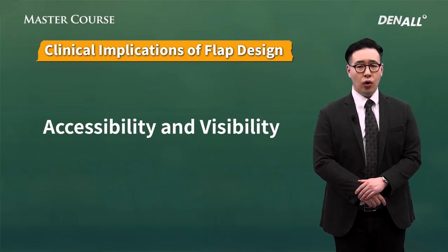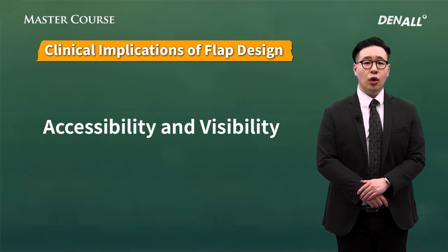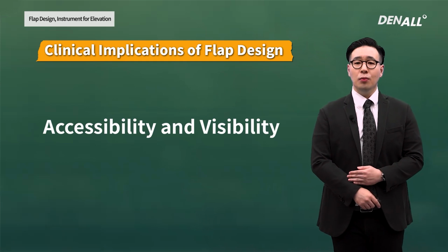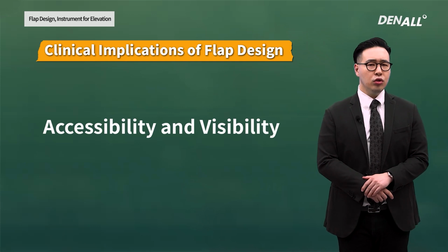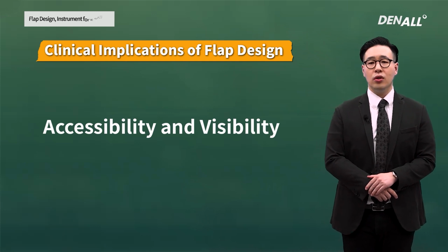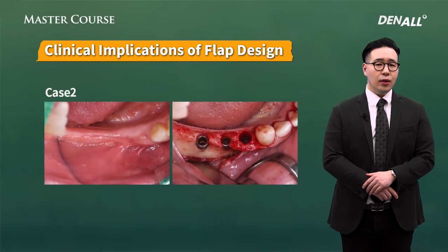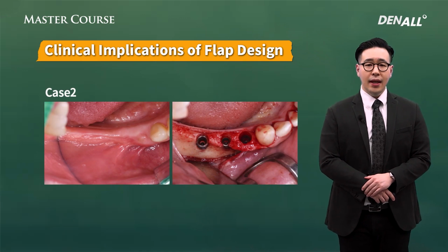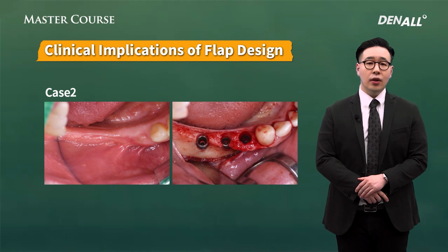In surgery, you need to understand patients' cheek and lips, and you need to form flaps that fit the different surgeries. You need to elevate the flap accurately and without damage, and this is the basic. If you get this right, specific surgical techniques you can garner with repeated experience. You can see horizontal bone resorption here, and you'll come across these cases almost every day clinically.